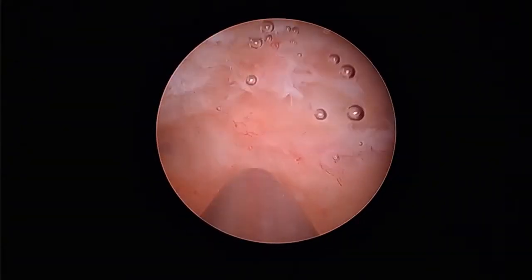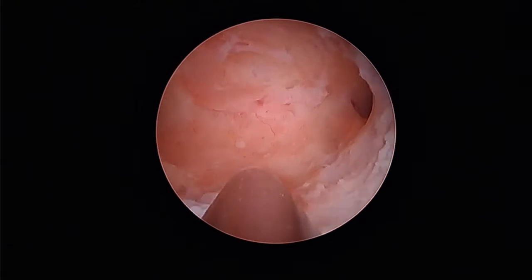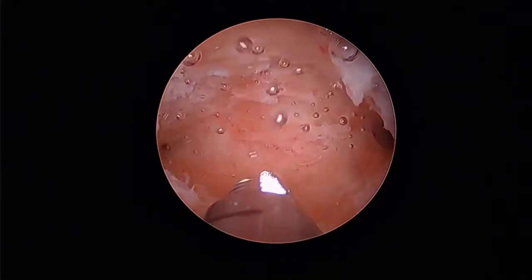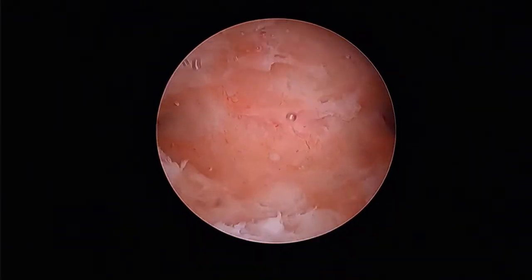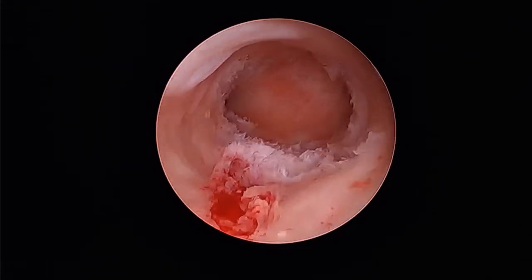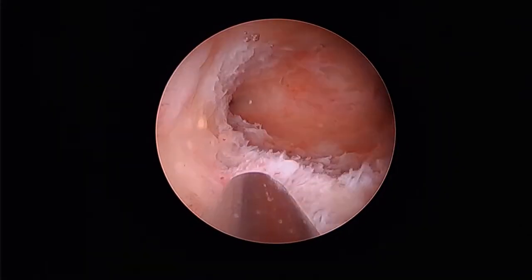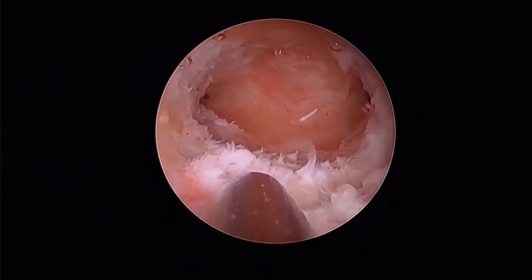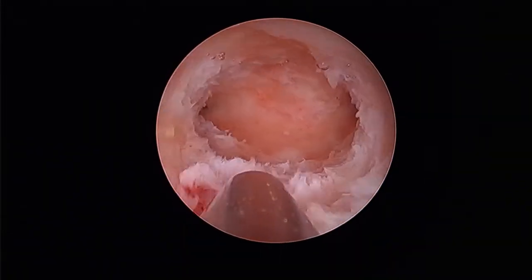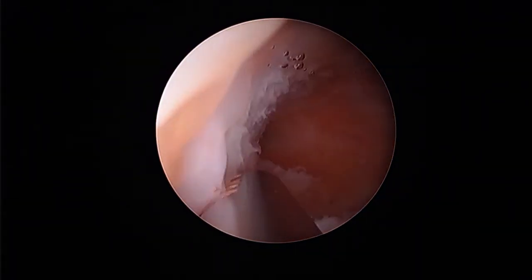The morcellator is reducing the endometrial tissue more. We now retract the morcellator. We have a full view of the endometrial cavity and we see bilateral tubal ostea at each angle of the endometrial cavity.